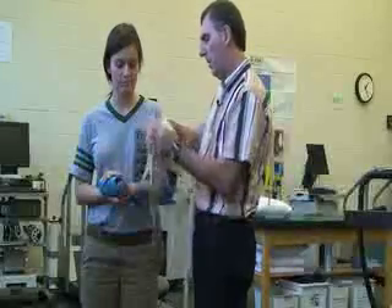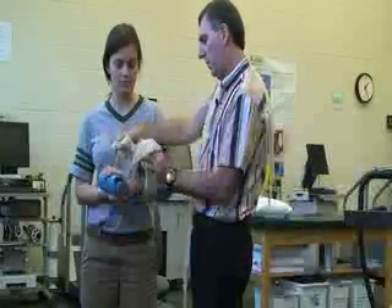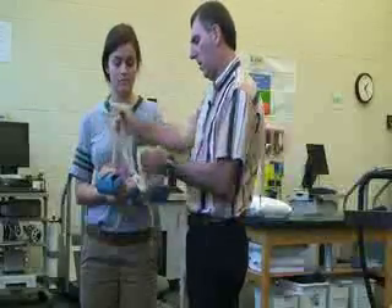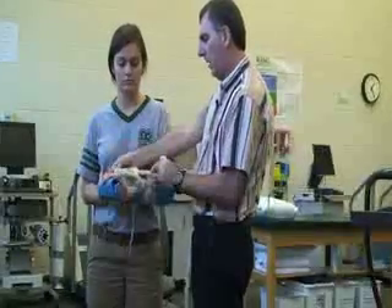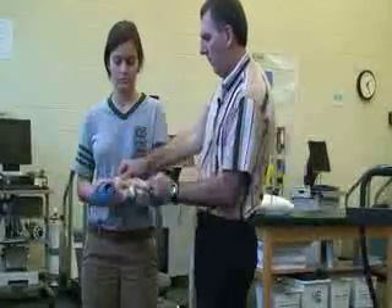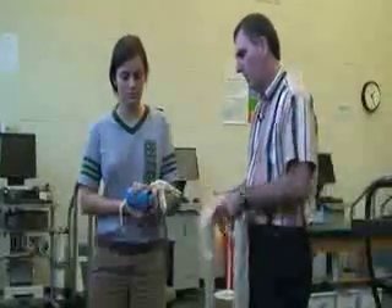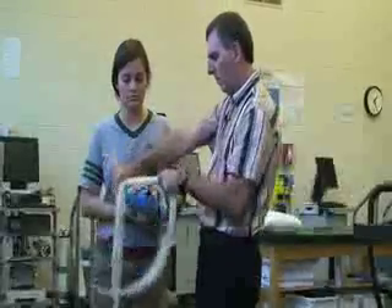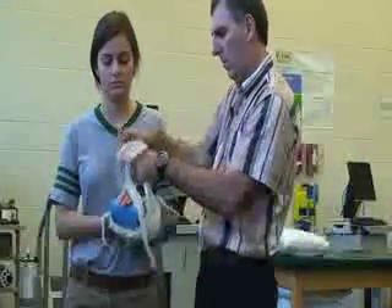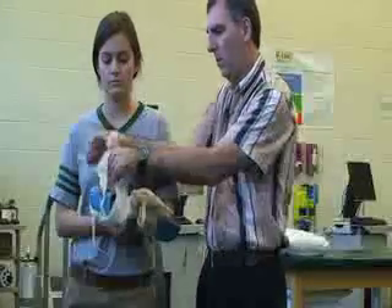Just above and below the injured site. Talking to the patient to make sure it's not too tight or too loose. I'll apply another one, going above the injured site which is at the wrist.